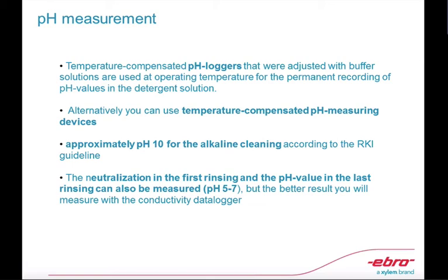Alternatively, you can use temperature compensated pH measuring devices. The neutralization in the first rinsing and the pH value in the last rinsing can also be measured, but the better result you will measure with the conductivity data logger.